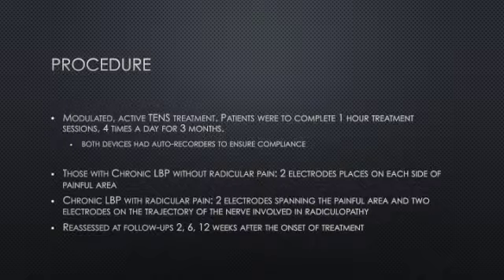Again, it was modulated TENS, varying from conventional to acupuncture-like TENS during the day. Devices were required to be used for 1 hour treatment time 4 times a day, and this went on for 3 months. Both devices had auto recorders. This ensured compliance both in the active TENS group and the sham TENS group, which the sham treatment did not administer any type of electrical stimulation.